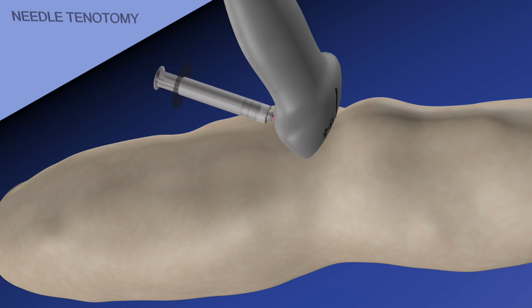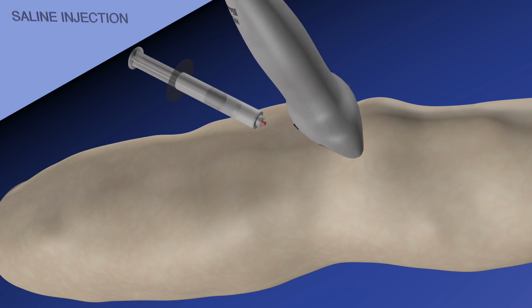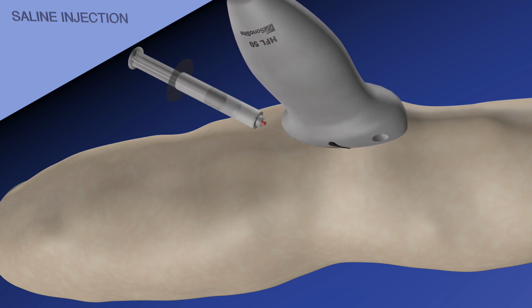And also it's good to look at the needle in a short axis plane or an axial view to get a better sense of the medial and lateral orientation of the needle. And here we are injecting saline, again with the needle in long axis or sagittal view relative to the body. And at the very end we're doing a cortisone injection.